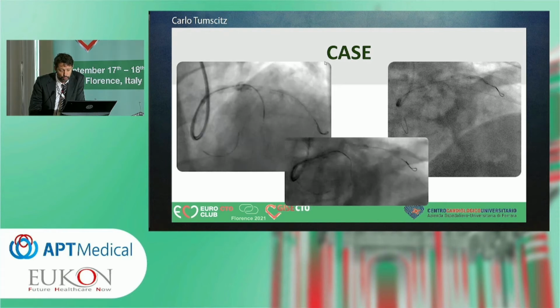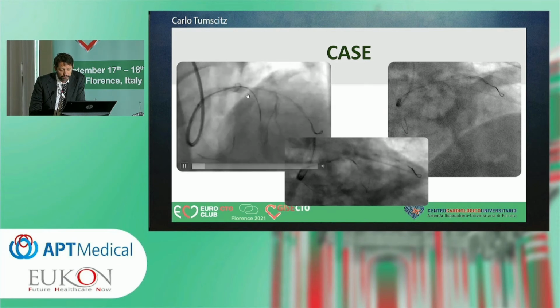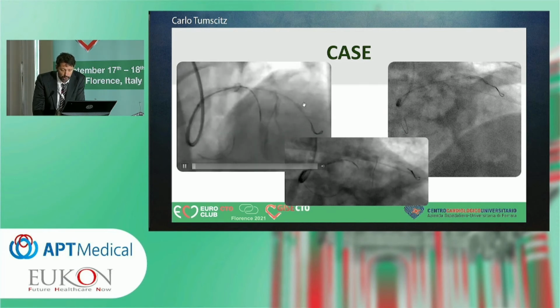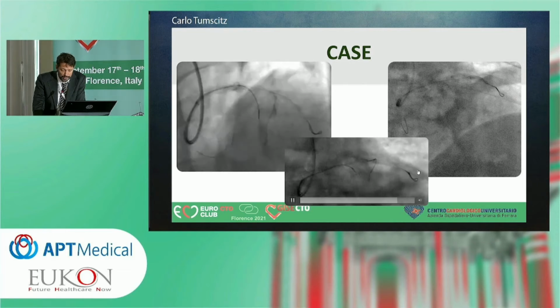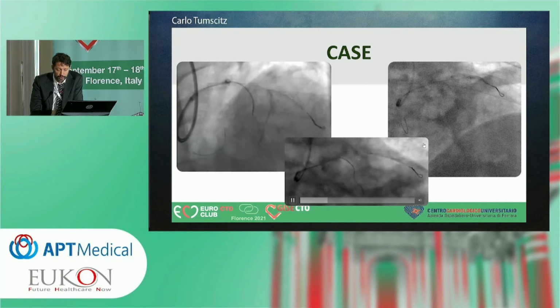With the SUO 3, and the microcatheter here was a conventional Corsair Pro, we were able to go down, and as you can see, we finally reached the other guide wire in the diagonal.